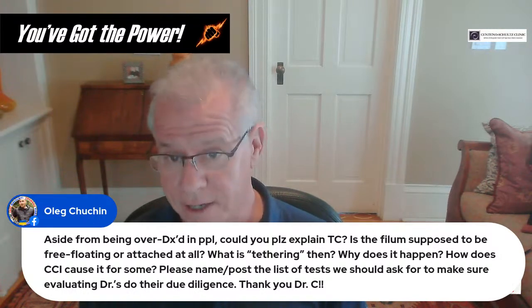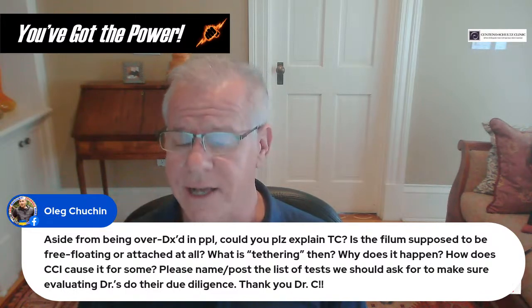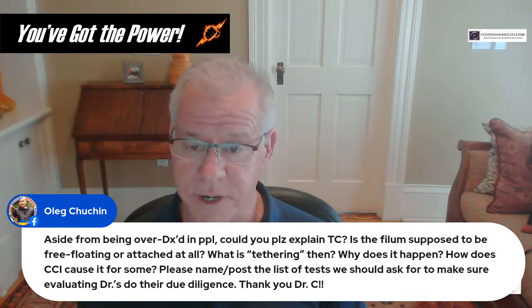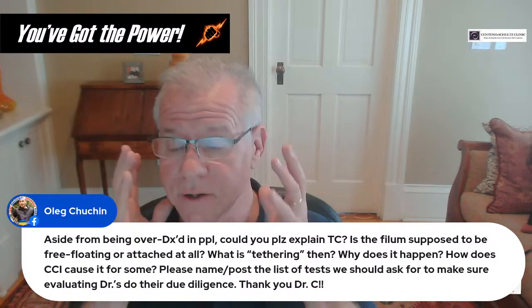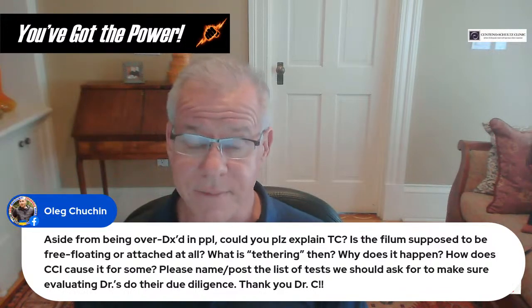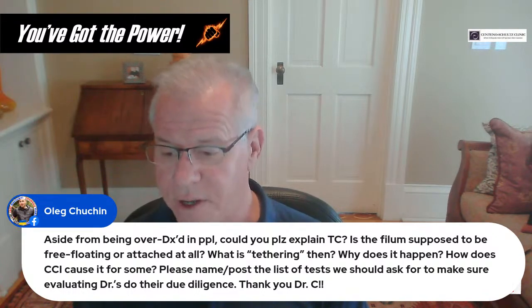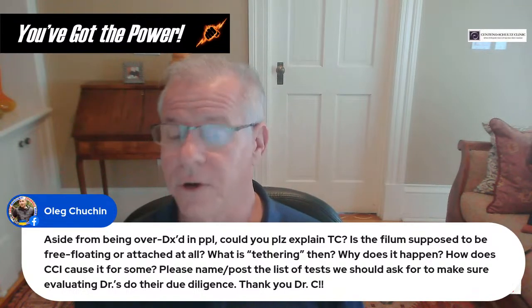The theory is that if you've got craniocervical instability, more due to EDS, then you may be pulling on that cord. What I tend to see more commonly is that the surgical correction, which often involves treatment for vertical instability, is to pull the head up by 1 or 2 centimeters, hence putting more pulling pressure on the cord. And then people need to be detethered. Now, do they need to be detethered? No one knows.